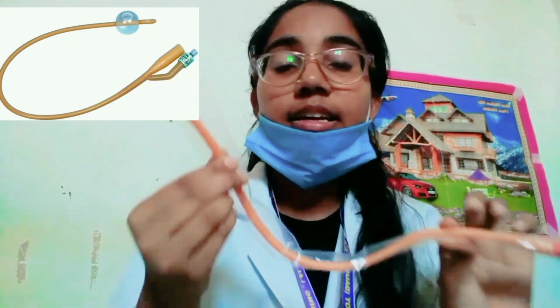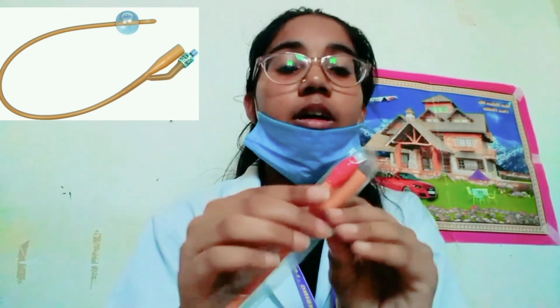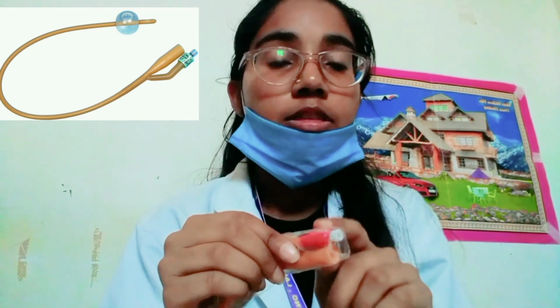It is also called a retention catheter or indwelling catheter. This catheter is a double lumen catheter. The large lumen is used to drain the urine from the bladder. The small lumen is known as the inflation valve, used to inflate the balloon near the tip of the catheter to secure the catheter in place within the bladder.